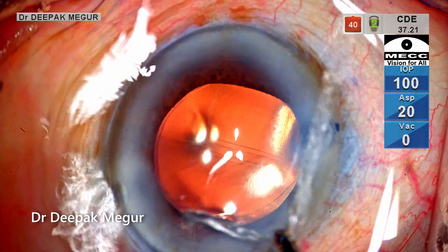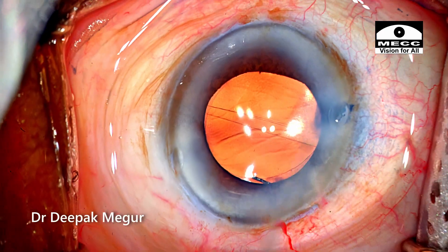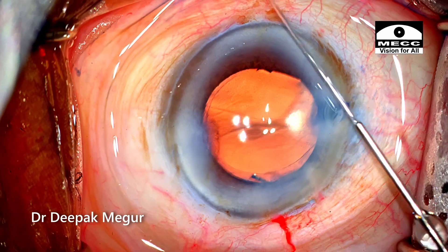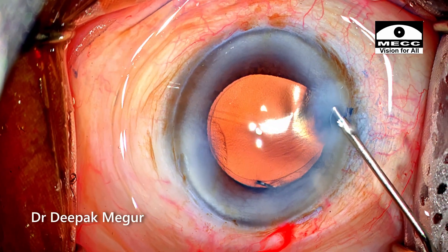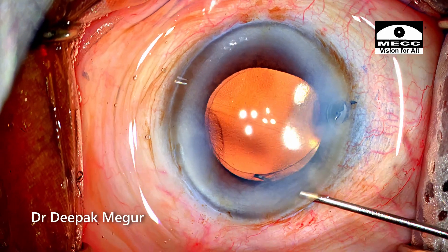OVD behind and in front of the lens is removed. Please note the posterior capsule folds, classically seen oriented perpendicular to the origin of the haptics. These are nothing alarming and they usually don't cause any issues with the vision of the patient. The side ports are being hydrated. That's it — the case is done.